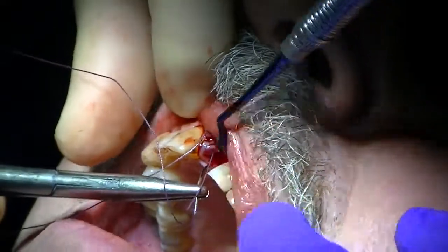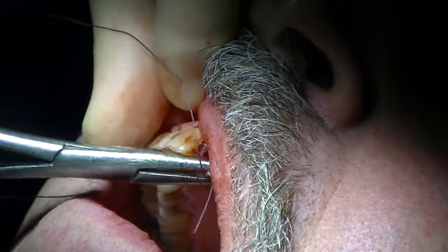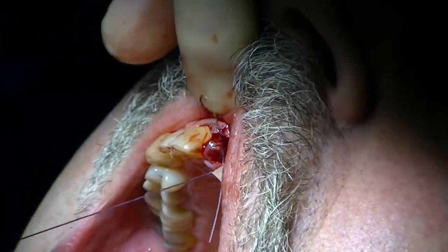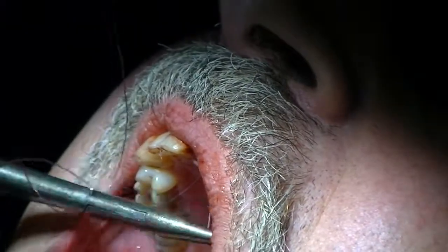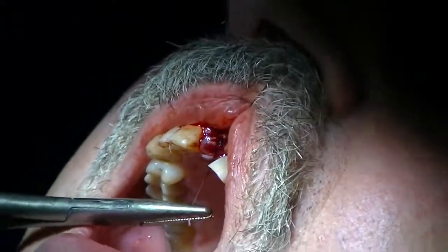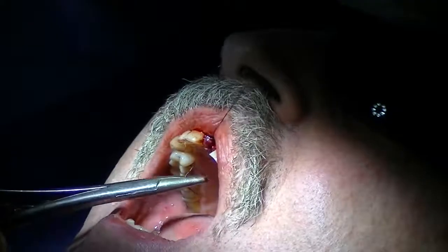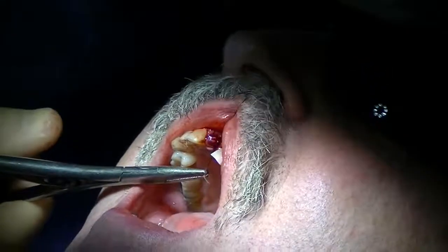I'll go from crestal to palatal. And same thing, 2, 1, 2. That knot will not come loose.